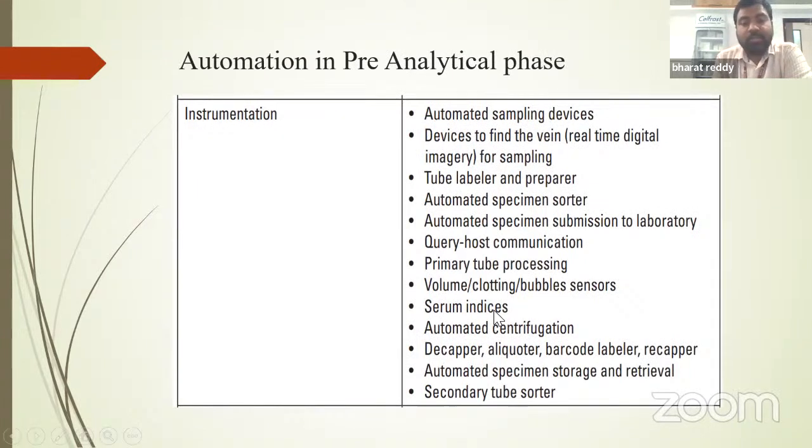And then instrumentation. What are the instruments used in the pre-analytical phase?